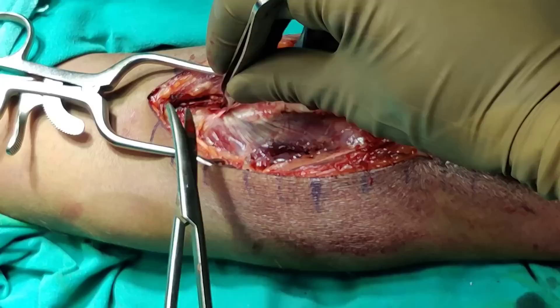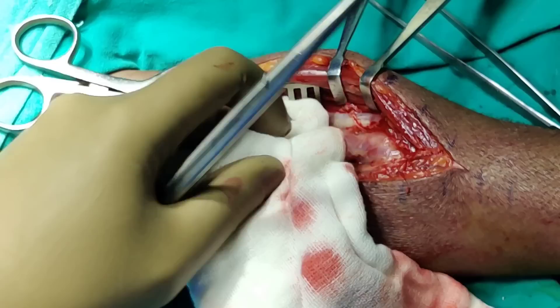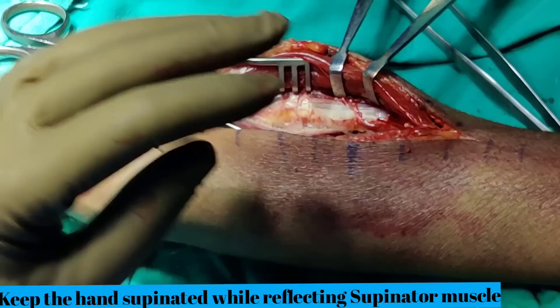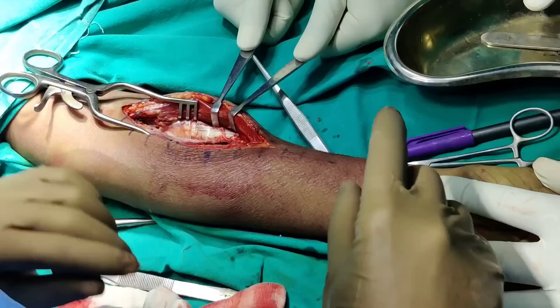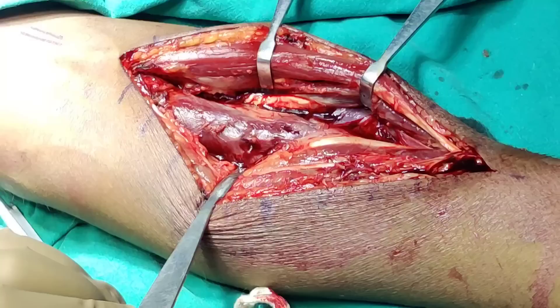Once you have done your superficial dissection, you will see the supinator muscle right in front here. Before you start cutting the supinator muscle, the most important thing is the position of the hand. The posterior interosseous nerve, which is the most important structure for this particular approach, goes underneath the supinator. In order to displace it, you need to supinate the hand so that the nerve displaces laterally as well as posteriorly. You must keep the hand supinated when doing your deep dissection and reflecting the supinator. Your next step is to reflect the supinator muscle so that you can see the proximal aspect of the radius.